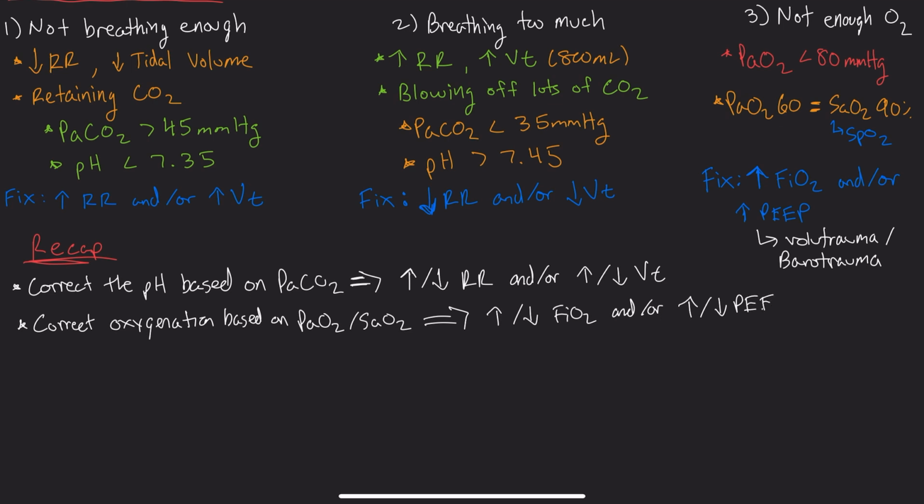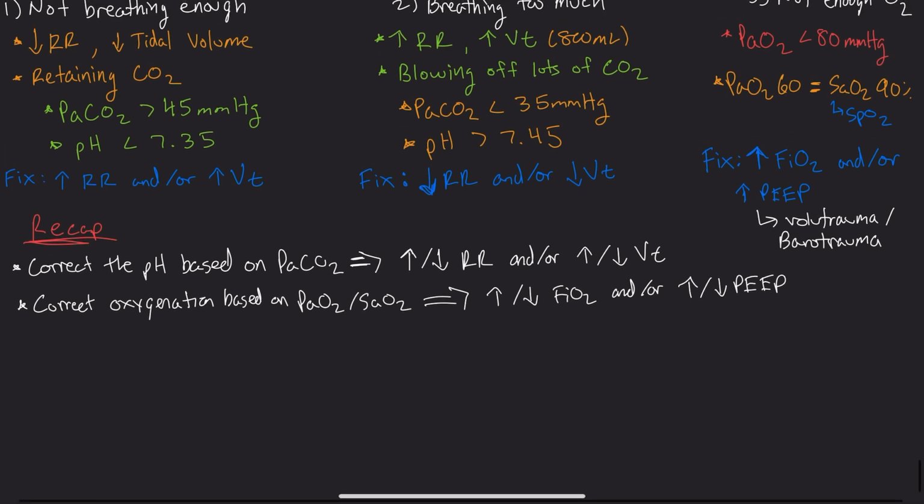Now, we didn't cover, it is possible that they are over-oxygenated, right? And then this would be, example 3 would be opposite, but for this video, we're going to stick with these main 3 here. So this is the big recap. This is kind of the main lesson. If you can understand this, then you should be able to walk through some of these examples we'll do here. All right, let's knock out some examples real quick.